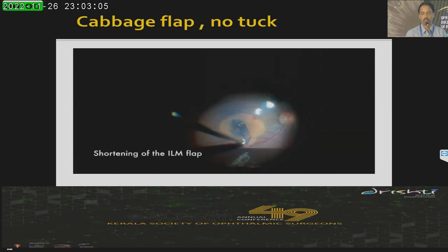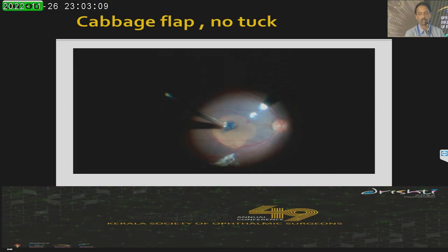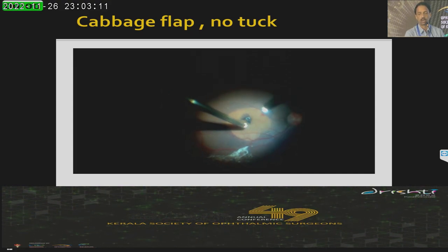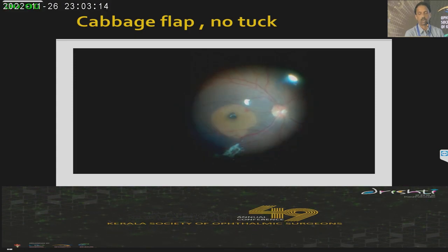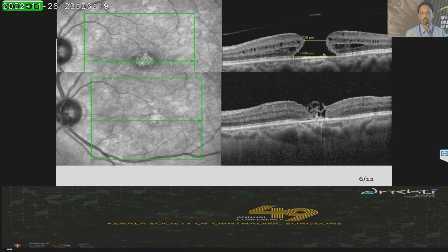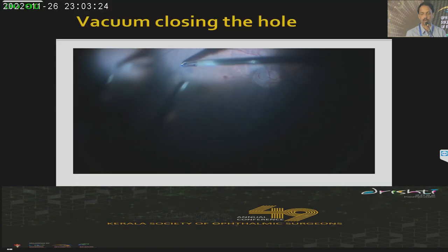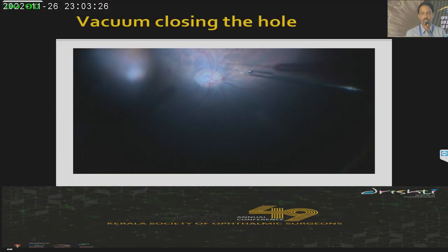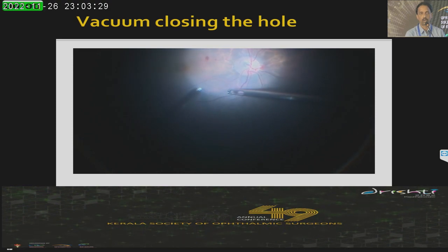Dr. Unni does 'cabbage flaps' — he prunes the flaps around the macular hole and without any tucking, just does a fluid-air exchange. These holes also close excellently well. For a little larger holes, I do a vacuum closing of the hole — after ILM peeling across the fovea, I do a small fluid-air exchange right at the macular hole. I believe that without any intervening tissues, these holes close better and there is early drying.